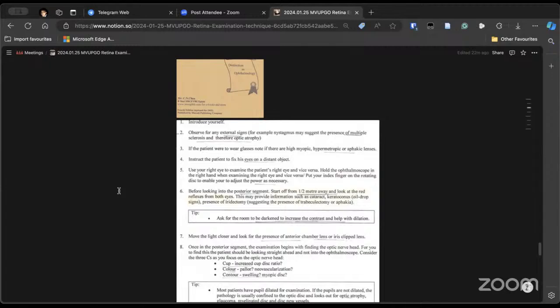When the patient sits, make sure that the patient is comfortable, and usually their head or eyes should be at your level so that you do not need to stoop much. The patient should look at the distance. That helps the patient to fix also. If the patient is not dilated, then when the patient looks near, the pupil will definitely be constricted. So if the patient looks at a distance, you have a better chance of getting the pupil dilated and examining the eye. When you are examining the right eye of the patient, you use your right eye.